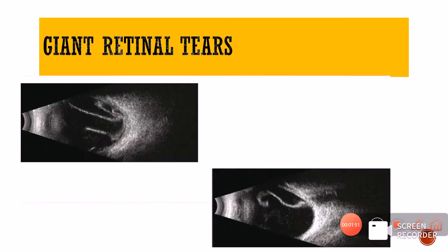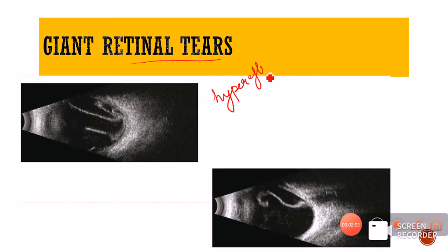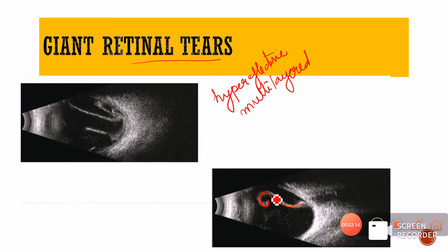These are cases of giant retinal tears. Giant retinal tears will look like a hyper-reflective, multi-layered structure — they are hyperreflective and also multi-layered, with a tendency to fold over each other. Here is another giant retinal tear — you can see how it is curling, with the tear present and it has curled like this.